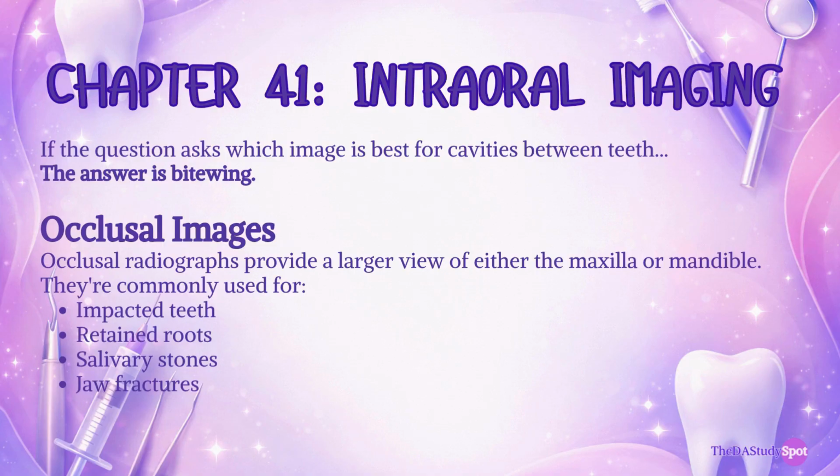Next, we have Occlusal images. Occlusal radiographs provide a larger view of either the maxilla or mandible. They are commonly used for impacted teeth, retained roots, salivary stones, and jaw fractures.